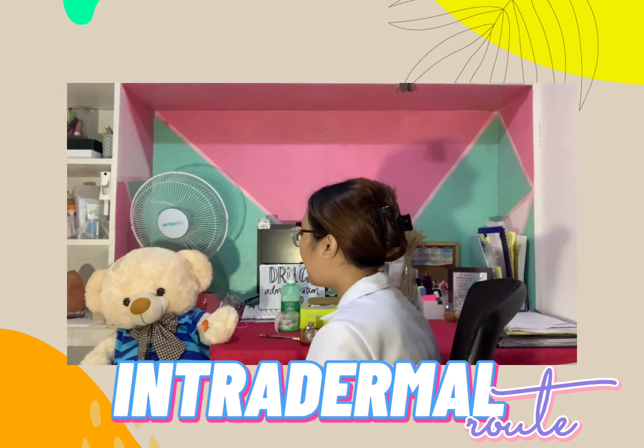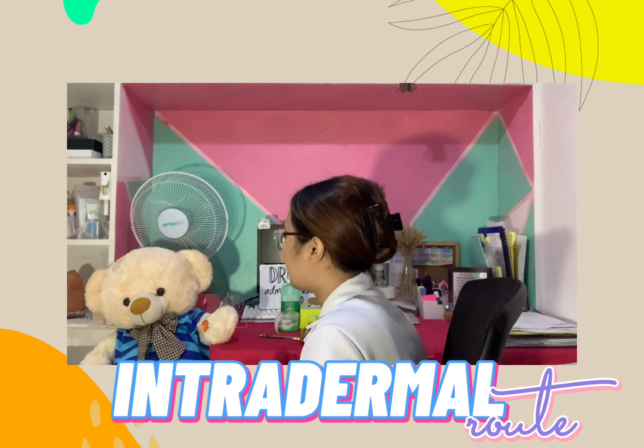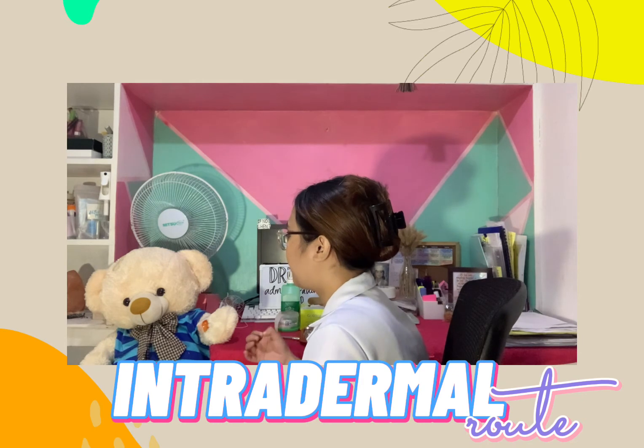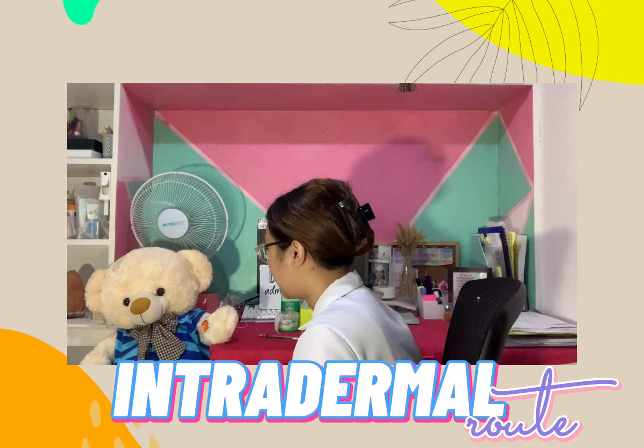So, ma'am, we are going to perform skin test po. We will test the clindamycin po, antibiotic po. We will assess po if you acquire the allergy po on the said medication before we administer the proper or the ordered dose for you po. Ma'am, is that okay with you po?